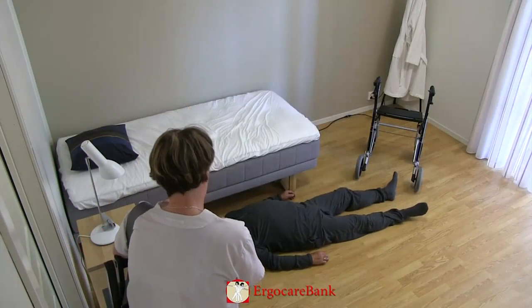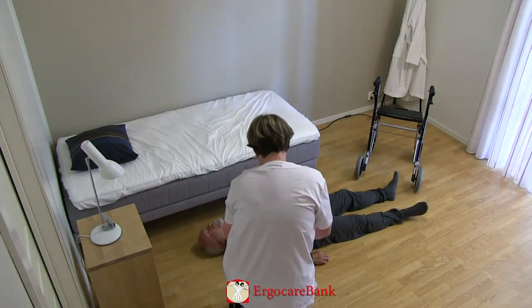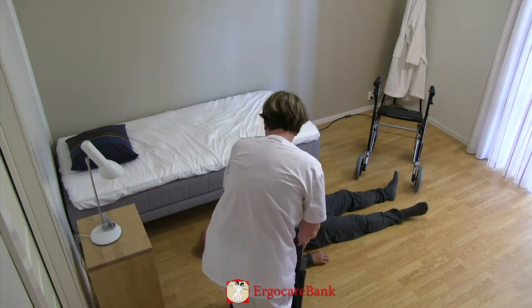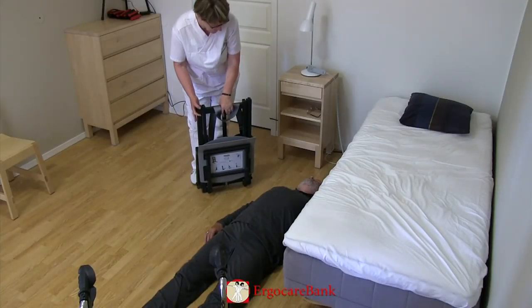Bert has fallen when he was getting out of bed. The staff member has checked that he has not injured himself and decided that he can be aided with the stand-up chair.